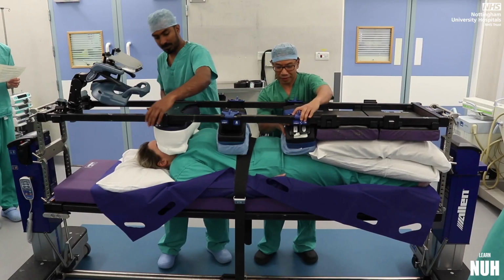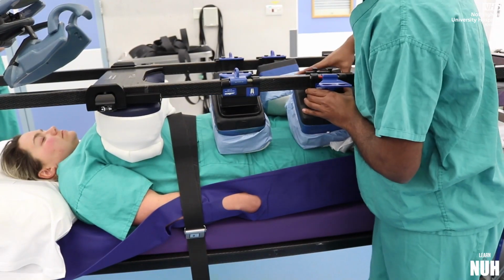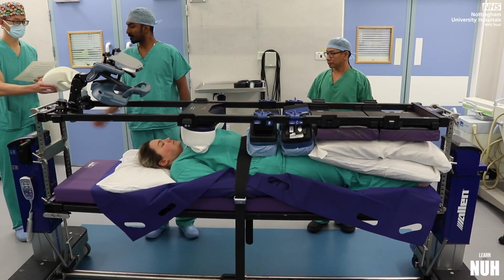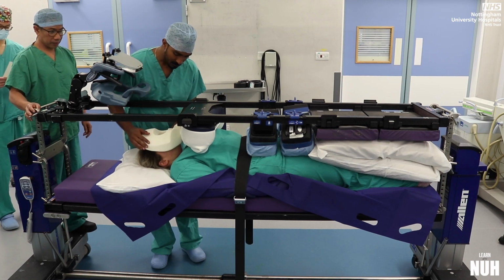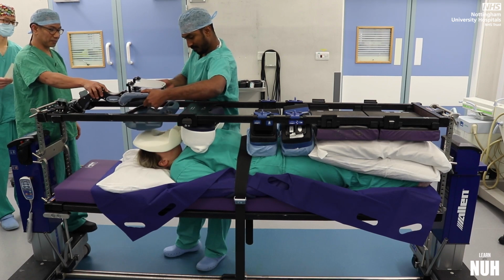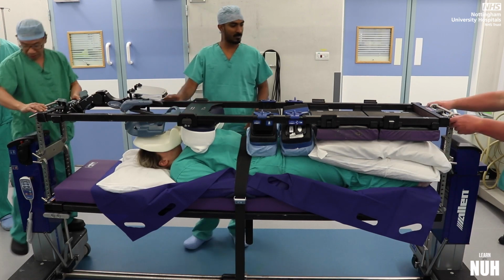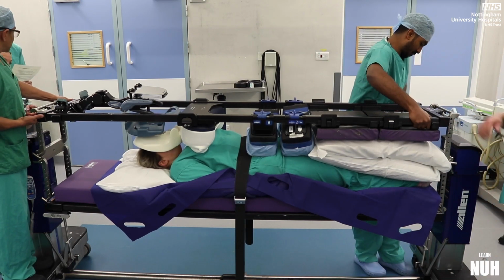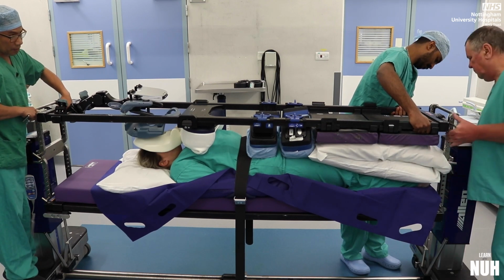The chest, iliac and thigh supports should be properly aligned. Attach the Mayfield clamp to the Allen table using the angled attachment. And the patient should be compressed snugly between the 2 Allen table frames. And the anaesthetist should confirm that the airway pressure is acceptable at this point.